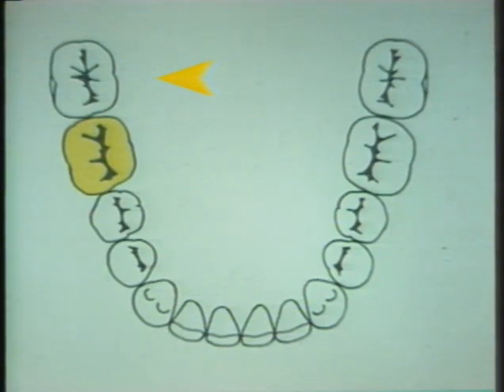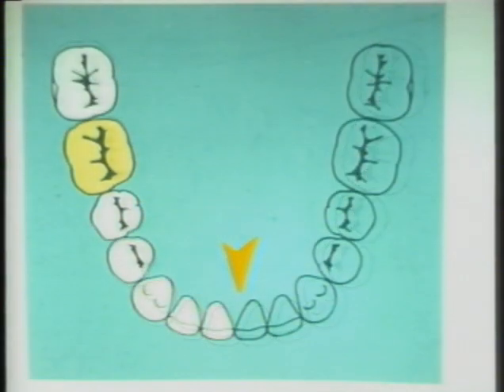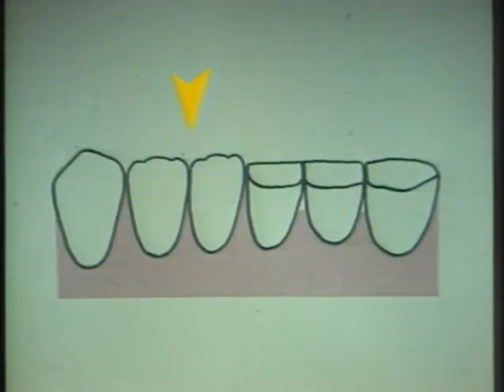Ideally, the posterior anchor tooth is at least one tooth further back, while the most suitable anterior anchor tooth is one with medium contact pressure and smooth enamel or restoration surfaces, so that the rubber dam in this illustration includes 7 teeth. Well-formed incisal embrasures are a help in guiding the rubber dam between the teeth, whereas sharp teeth, which have been worn flat and have their contact points at the incisal edges, are to be avoided if possible.